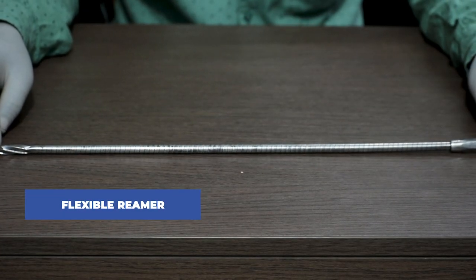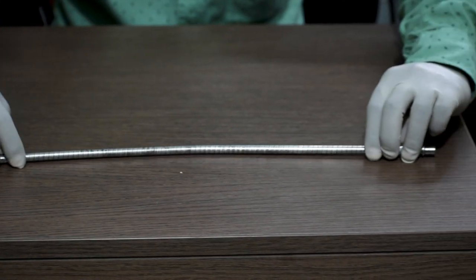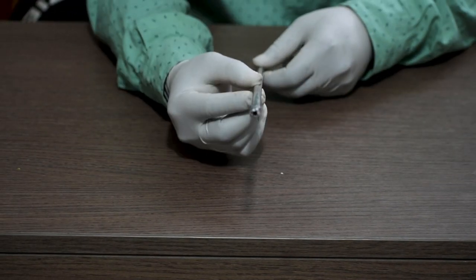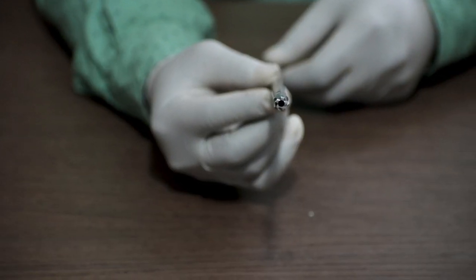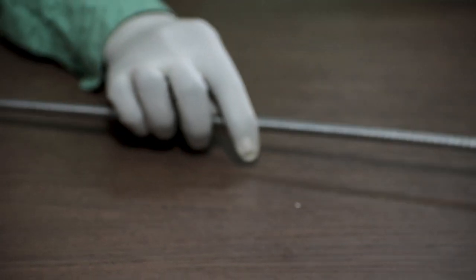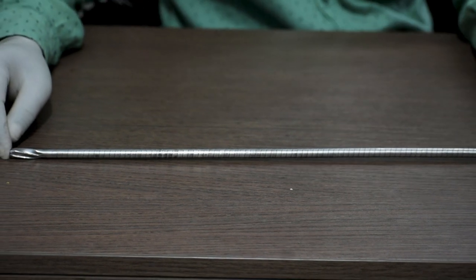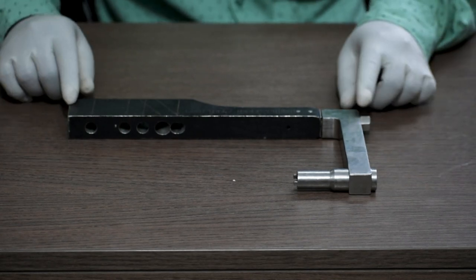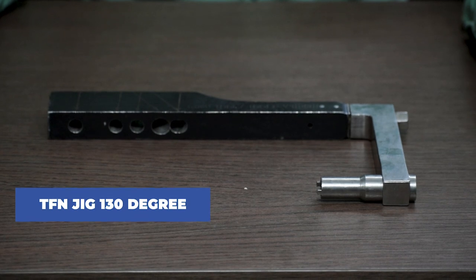This one is called a flexible reamer. This is also cannulated, available in sizes of 8 mm to 12 mm, either with a 0.5 mm gap in between or with a 1 mm gap in between, depending upon the company.